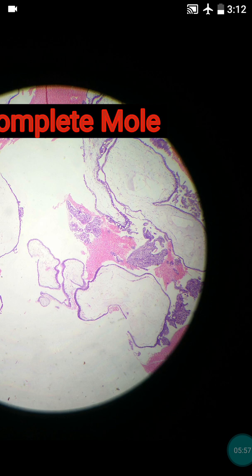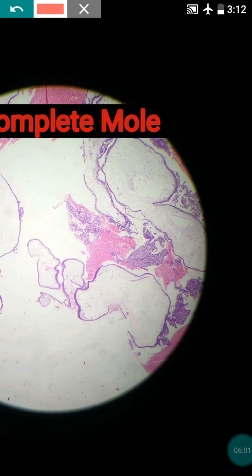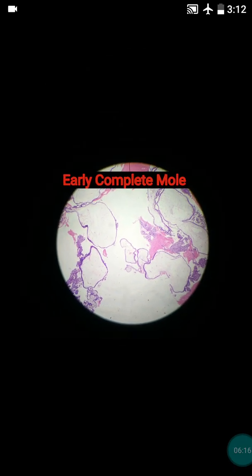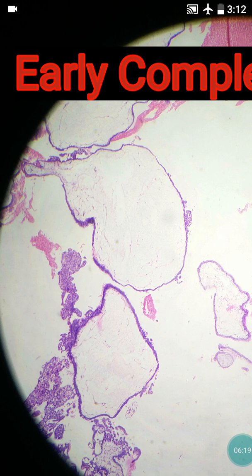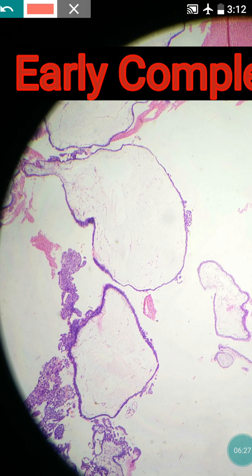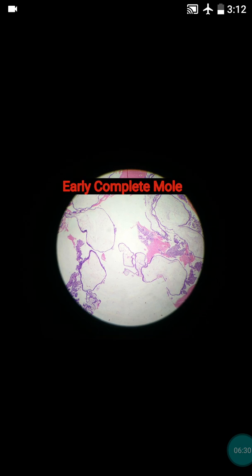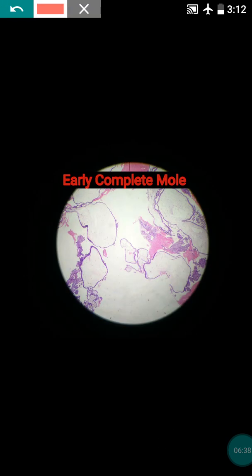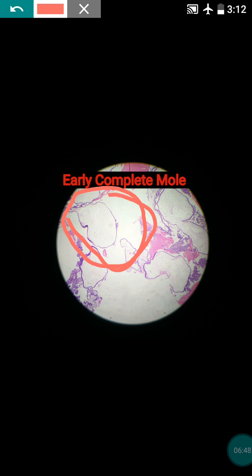Sometimes trophoblastic hyperplasia can produce invagination as well — usually this is a feature of partial mole, but here in some villi it was present. Kindly note one important point: blood vessels are totally absent in this hydropic villi. If nucleated red blood cells and blood vessels are seen, then you have to think about partial mole. This is a case of early complete mole, which is why we are not able to see the circumferential trophoblastic proliferation.